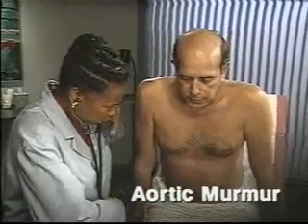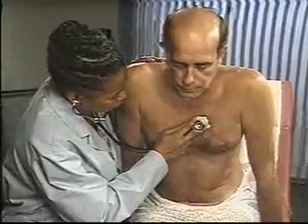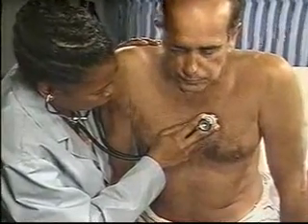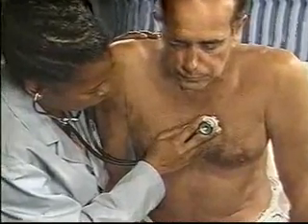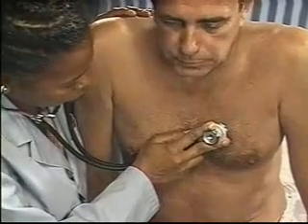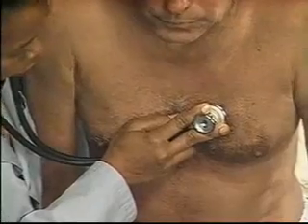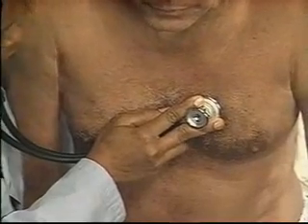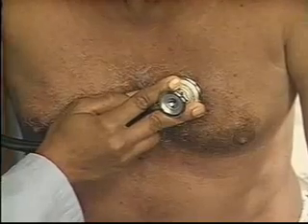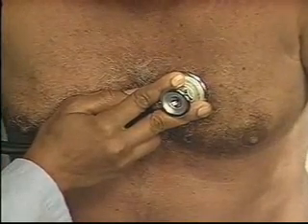To help detect aortic murmurs, especially that of aortic regurgitation, have the patient sit up and lean forward. Then ask him to exhale completely and hold his breath out. Using the diaphragm of the stethoscope, listen at the left second interspace and down the left sternal border to the apex.